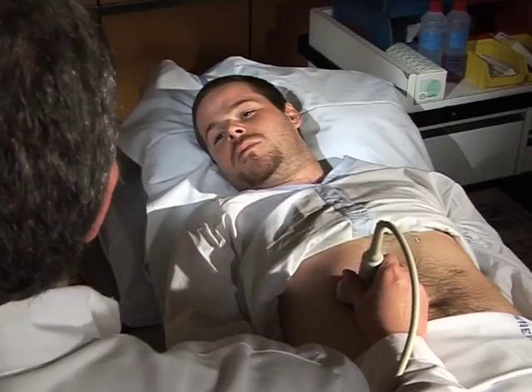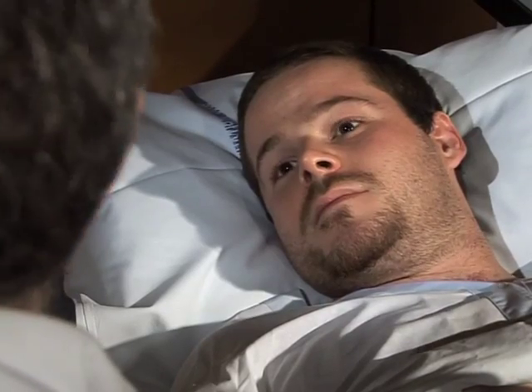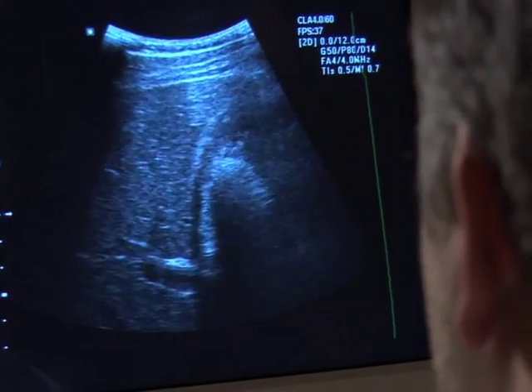Are x-rays used? Not at all. The probe emits ultrasound waves that enter the body and are reflected off the different abdominal organs. These ultrasound waves are then recaptured by the probe and transferred to the device that projects the images on the screen that you see here. We use the same procedure on pregnant women to see if the baby's doing well.